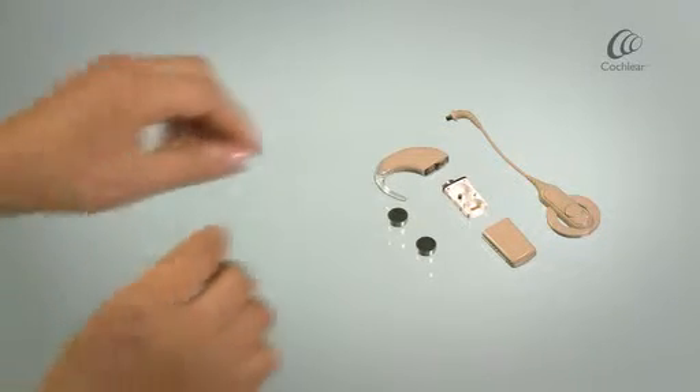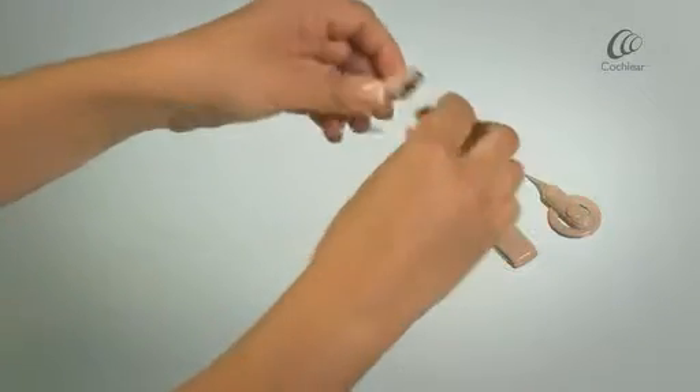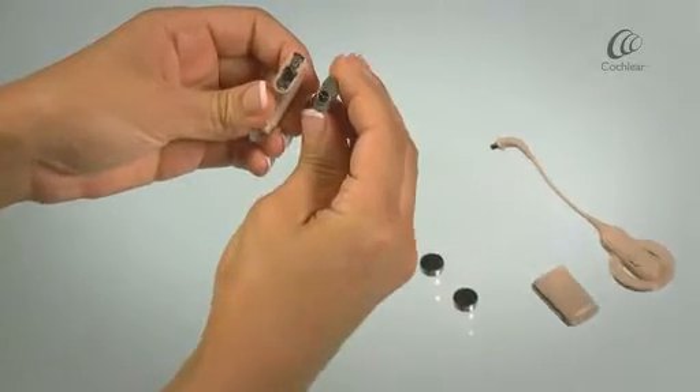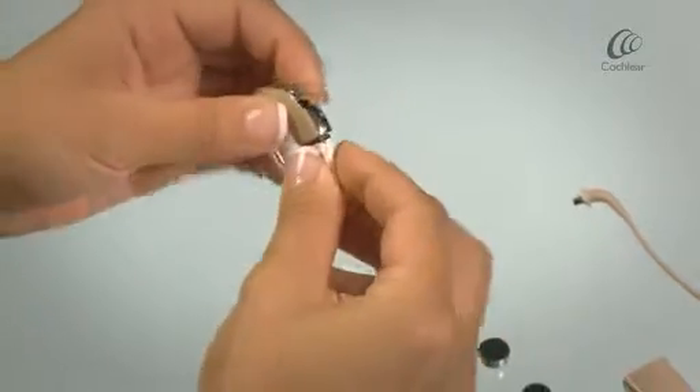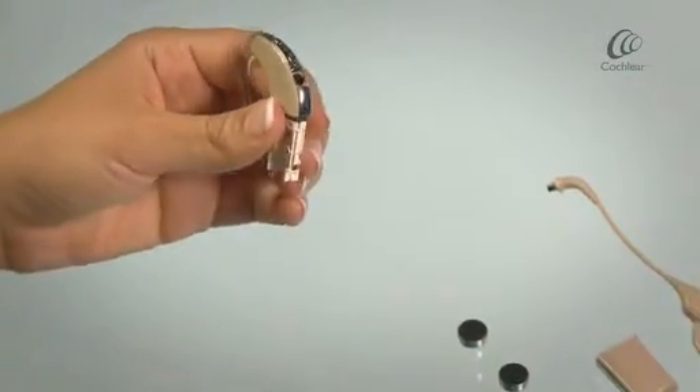Take your sound processor and battery module. The connectors will twist together. Ensure your battery module is locked to your sound processor.